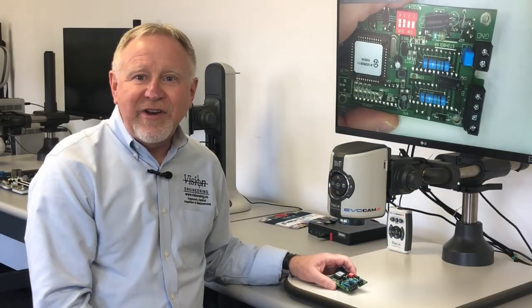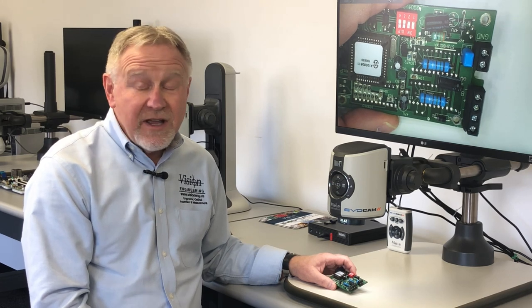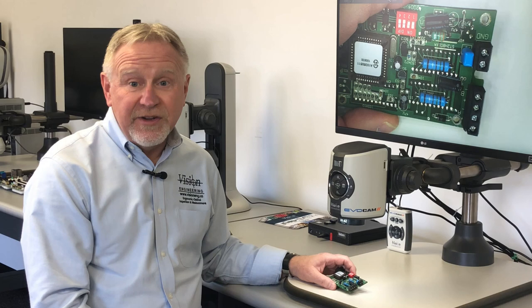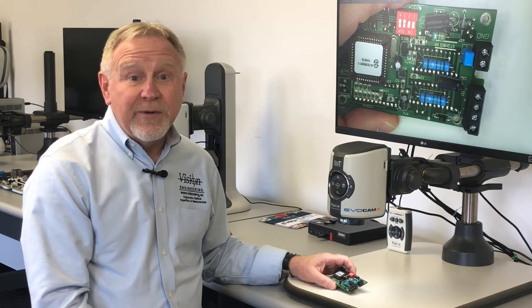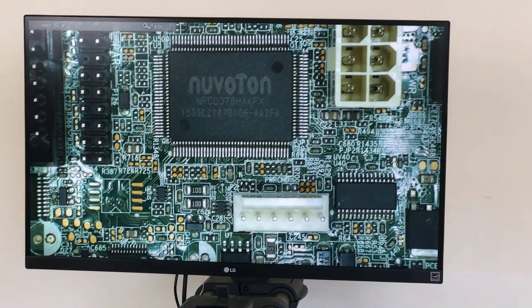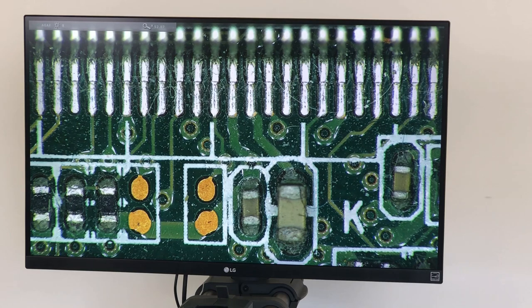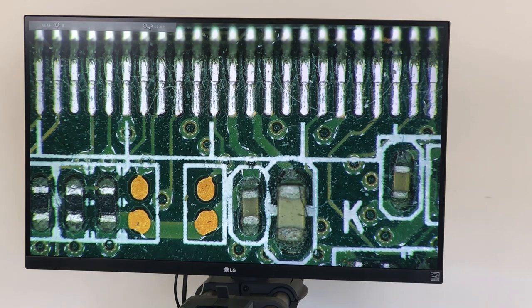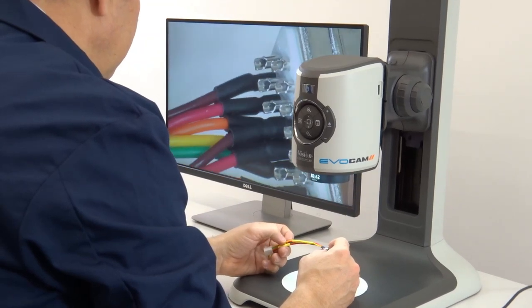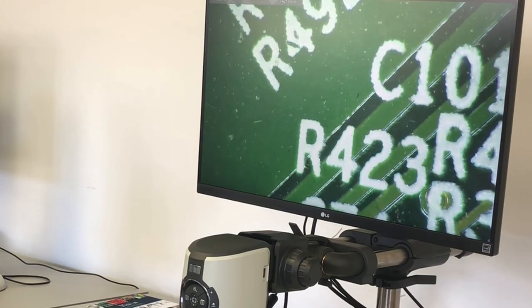The EvoCam 2 is a great alternative to a stereo microscope for many inspection tasks. It is not a direct replacement — in some instances stereo is the only way to go — but for many other choices the EvoCam 2 shines. It offers greater field of views, greater magnification range helped by our 30 to 1 zoom, greater working distance — five inches of working distance with a range of four times magnification to 105 times.